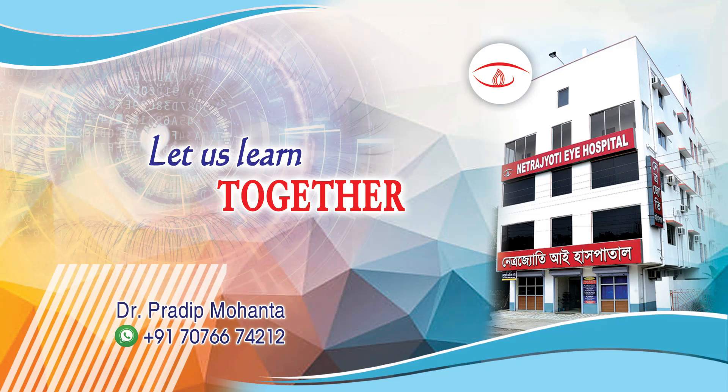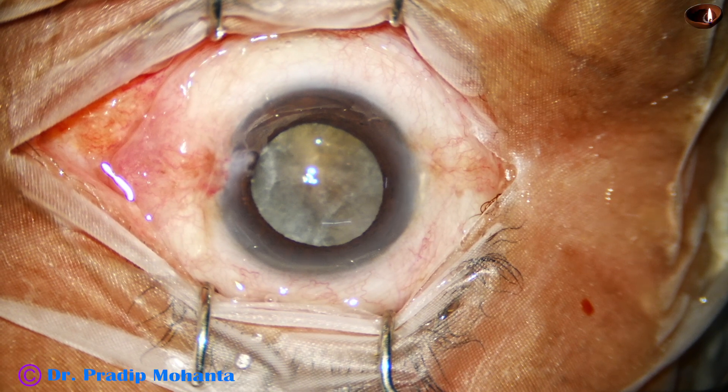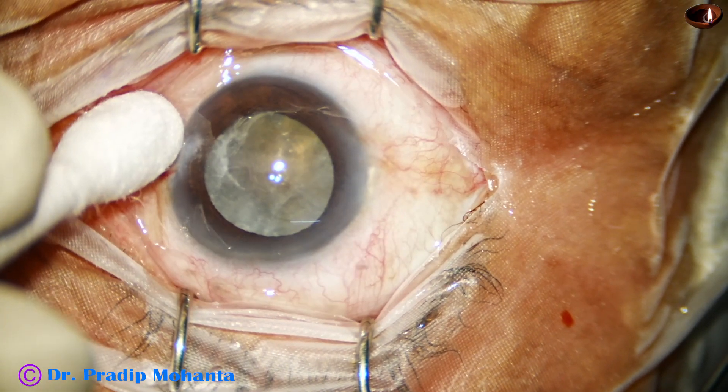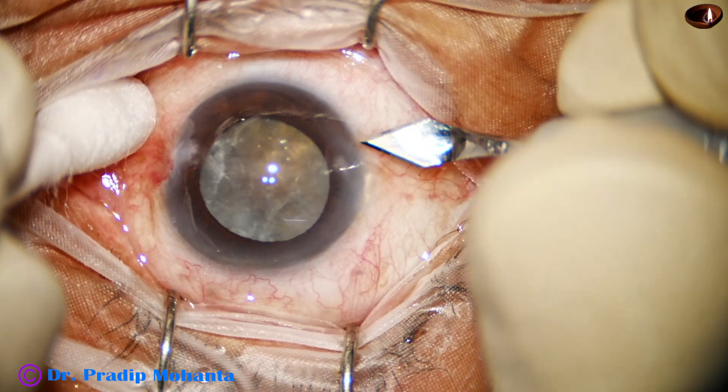Friends, welcome to my workplace at Ranakh Heart, West Bengal, India. This is a white cataract with hard nucleus. I didn't know how hard the nucleus was, so initially I didn't know whether I would be able to do FACO in this case or not.